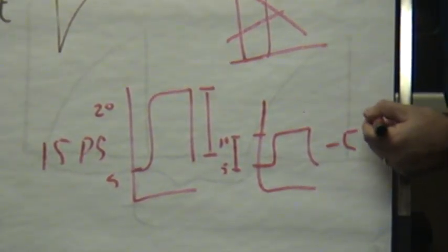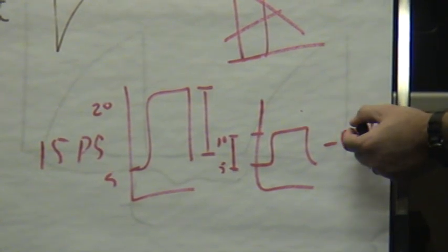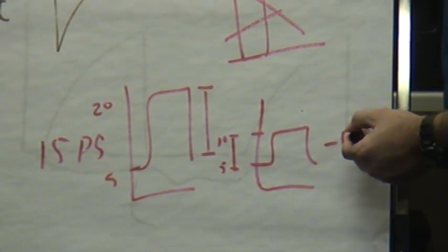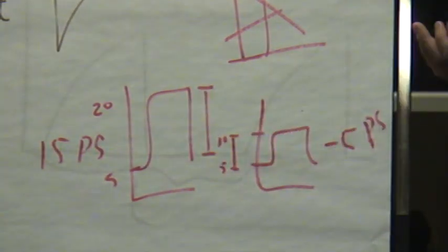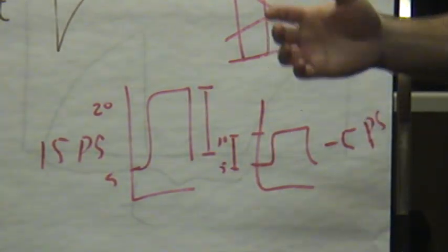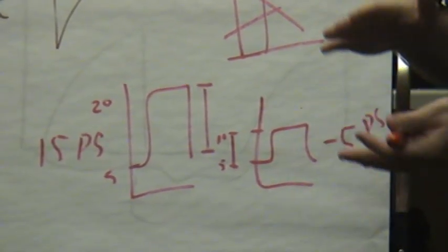Who's closer to being extubated? The 5. The vent is doing the least amount of work. The patient's doing all the work here. Over here, the vent's doing most of the work. Does that make sense? Same mode, same rate, same blood gas. But I can look at the difference between the PIP and the PEEP to see how much work the patient versus the vent is doing.